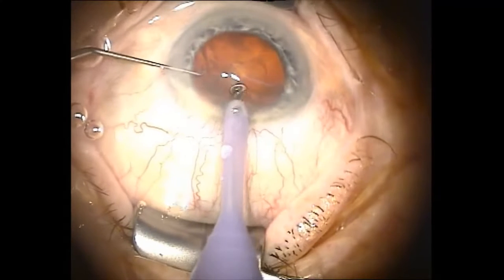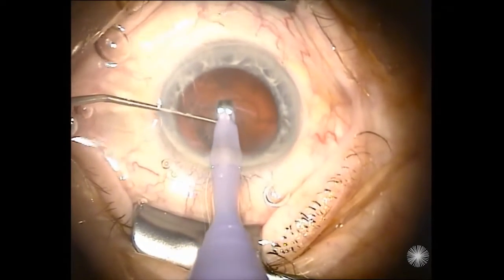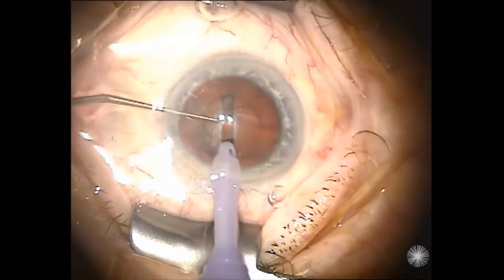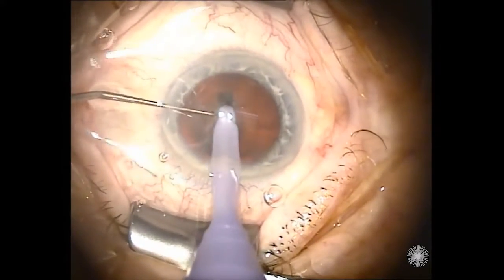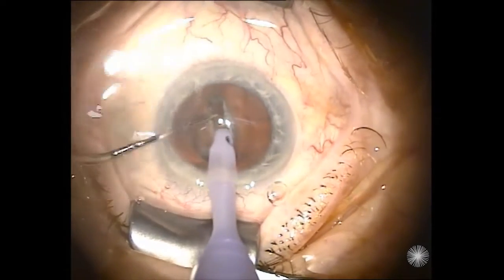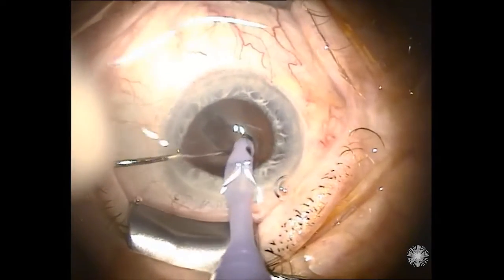In this video, we suggest a new approach of implanting iStent through combined surgery with phacoemulsification to correct the astigmatism a little bit in the eye. This patient has astigmatism with the rule. This means the steep axis is 12 o'clock. So we will put the main incision at 12 o'clock and implant iStent through a side port.